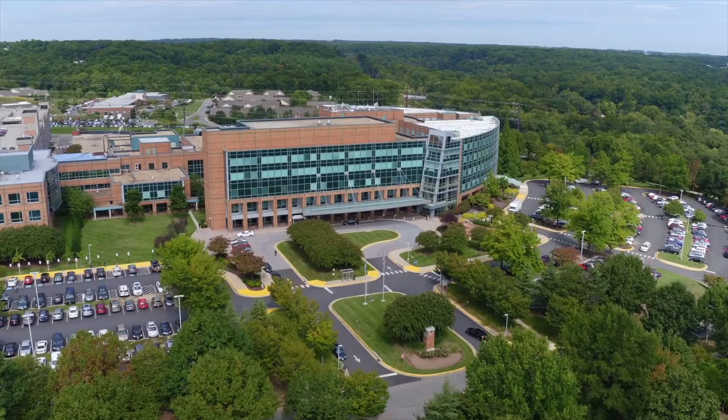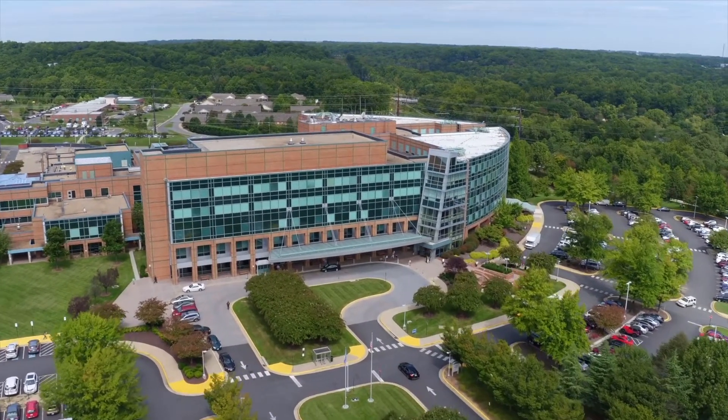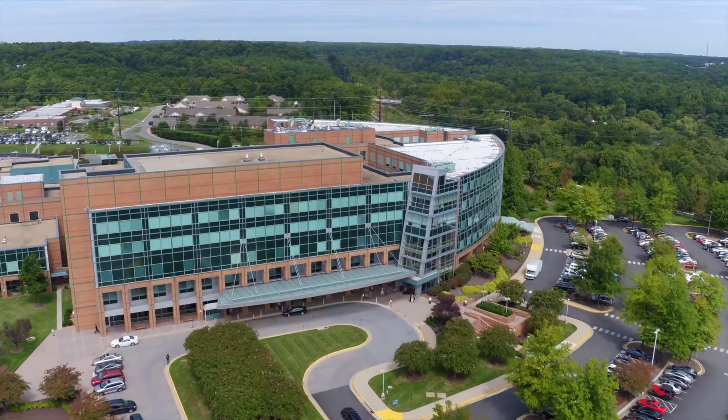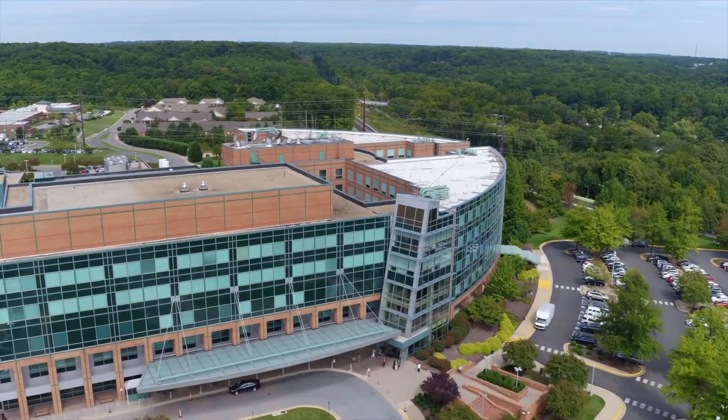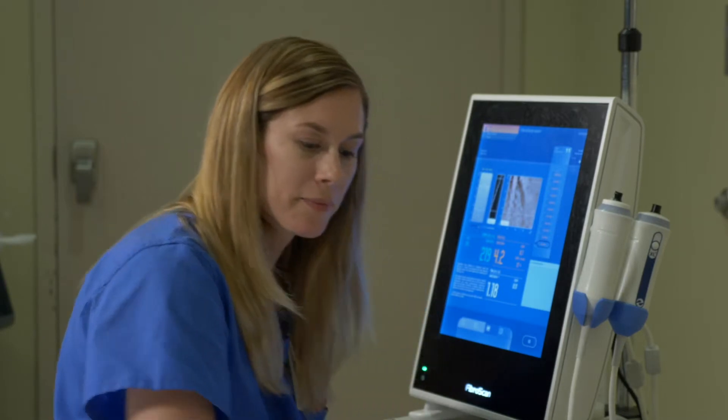This is how it is getting popular now. For our patient population, they had to travel at least one hour to get this done until we had it here. As far as the Fredericksburg area, only Washington Healthcare has this. This is basically for the care of the local population — we are trying to provide better care. I'm very happy that we have this here.